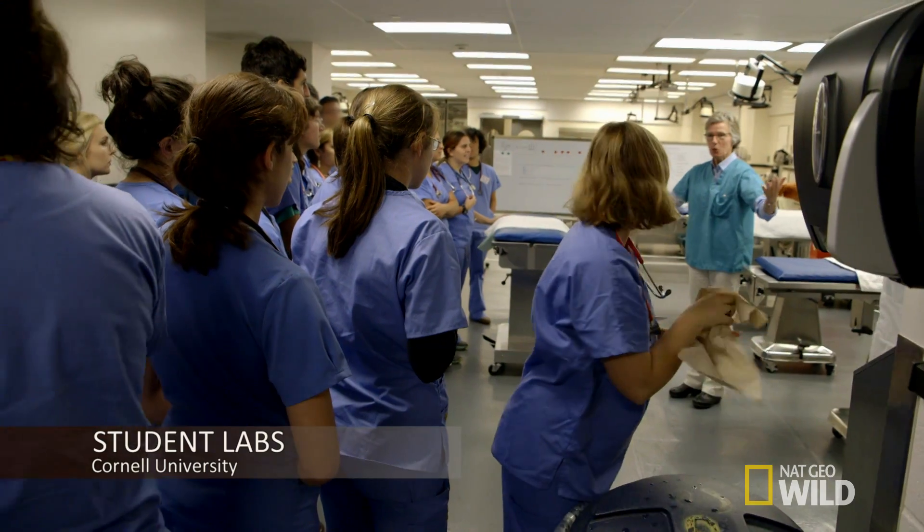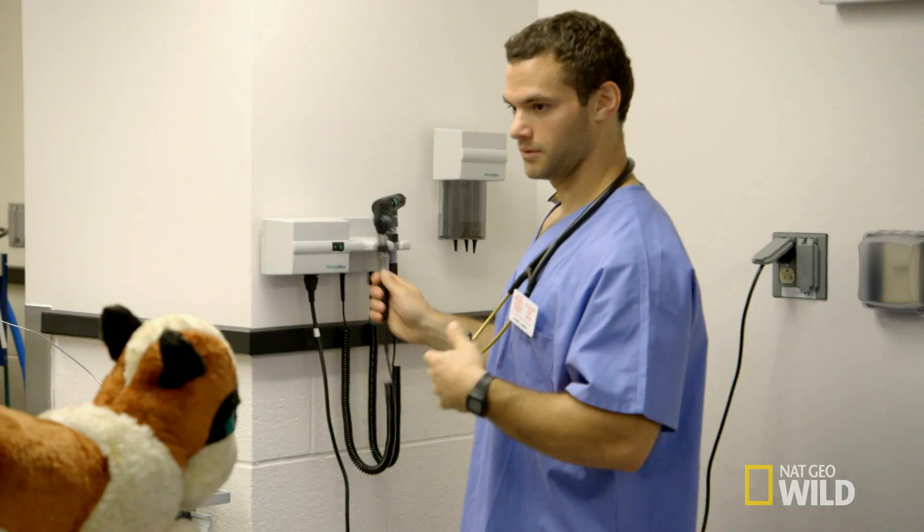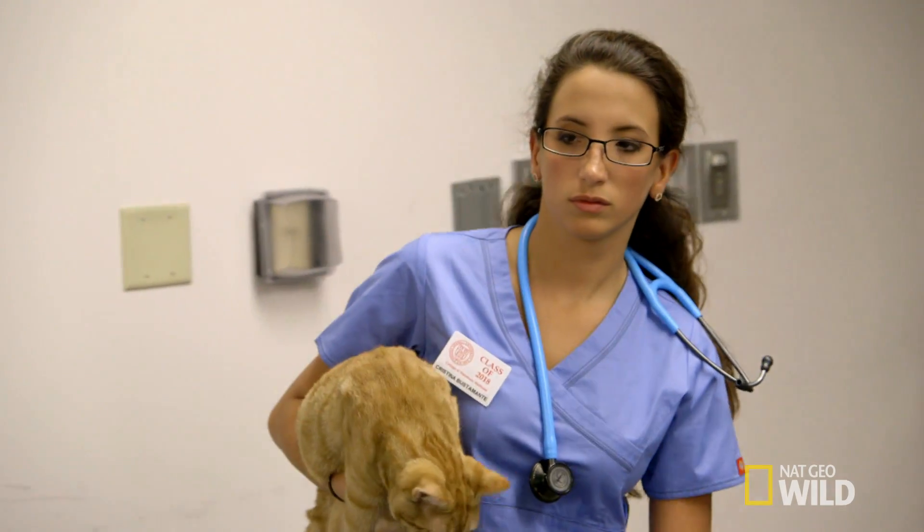First-year students have their ophthalmology lab to learn the basic structures of the eye. This lab concentrates on dogs and cats.